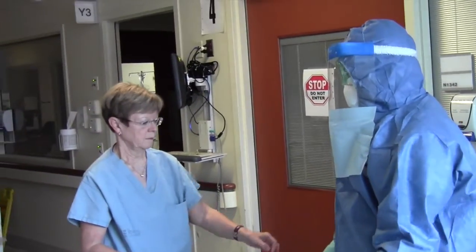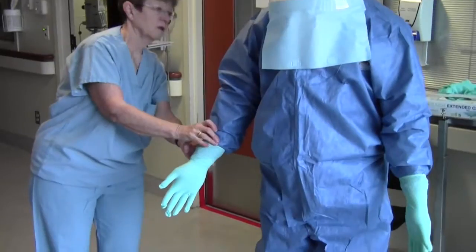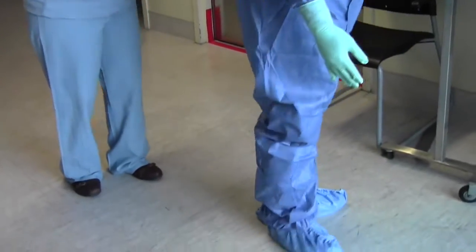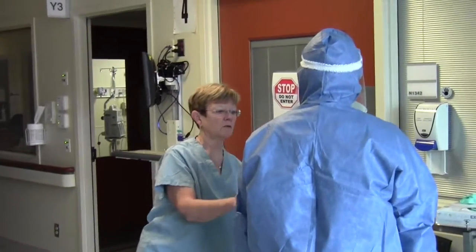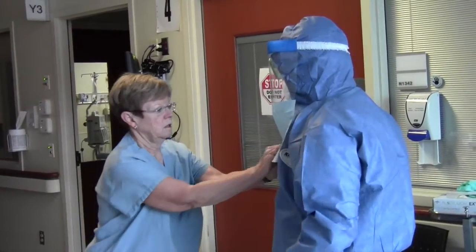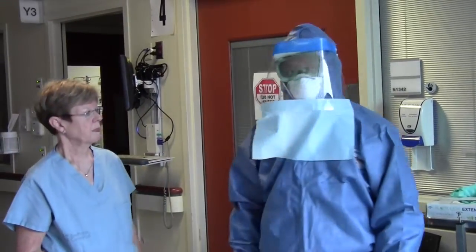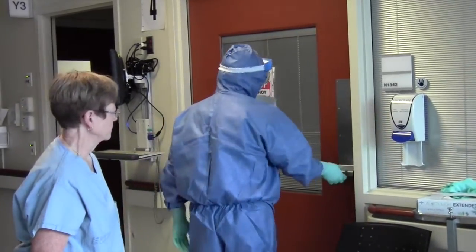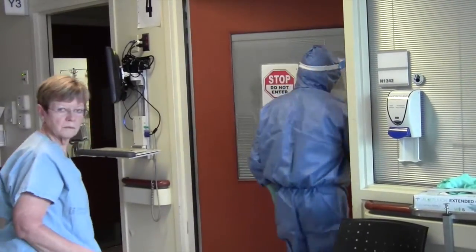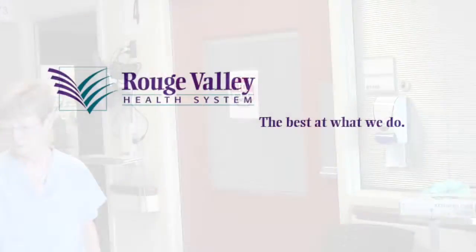Step 12. The clinician will now complete a 360-degree turn for the PPE observer to perform a visual inspection of PPE integrity and fit. The clinician is now ready to enter the Ebola room.